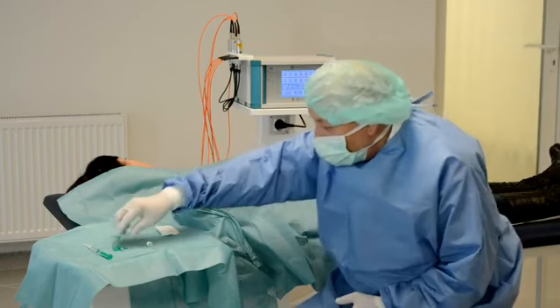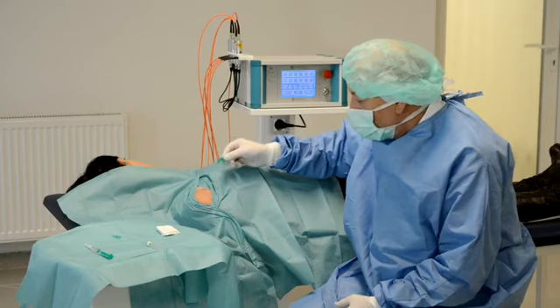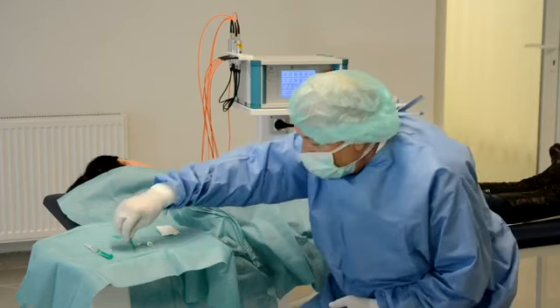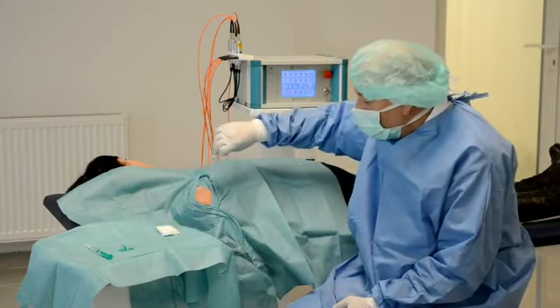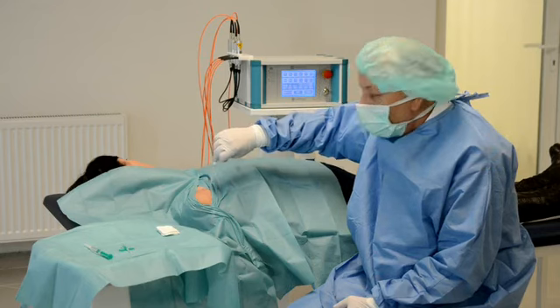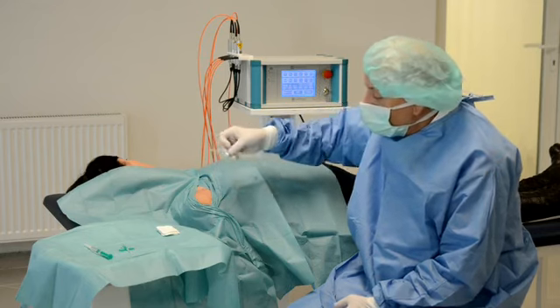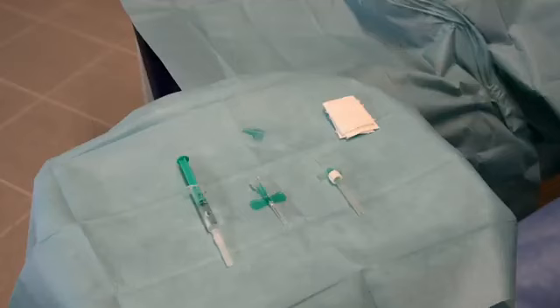We give local anesthesia in this area as usual, and we need a small butterfly needle, which we can put directly in the area of pain, or in tendon channels, or maybe even in the joint directly. And then we connect it with the laser device and a fiber optic catheter.